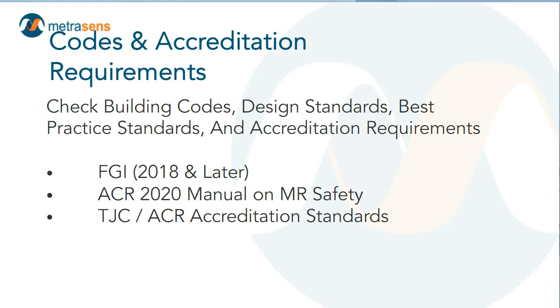And I'm going to require of my designers and of facility planners and radiology folks, make sure you understand what your accreditation is, which may be Joint Commission, TJC, maybe ACR, American College of Radiology, maybe other organizations. Make sure you understand both the explicit and implicit expectations of design requirements from your manufacturer.